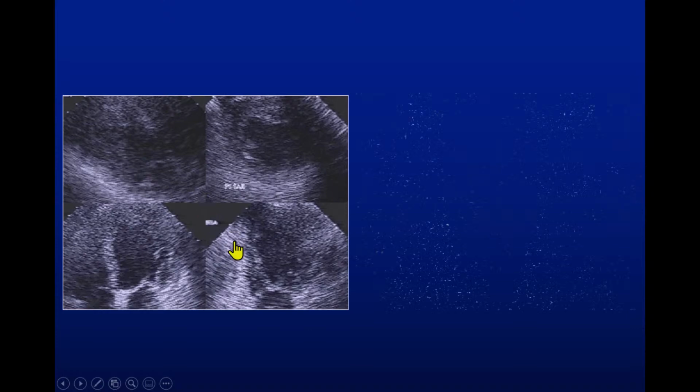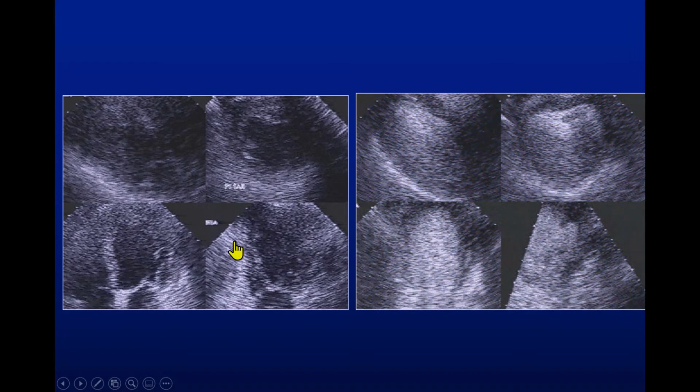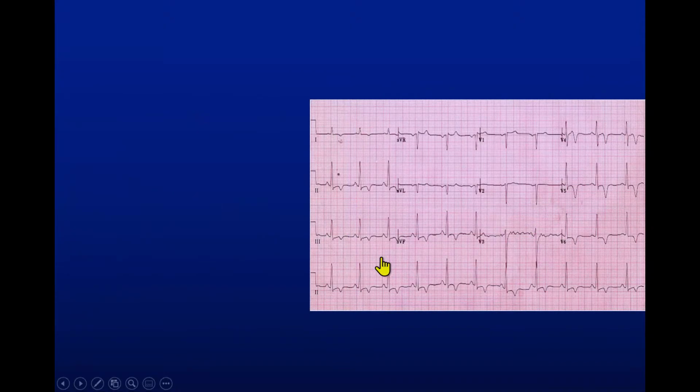Hopefully it works. Maybe it's not working. That's okay. Even on a still frame you could tell. I could not see anything here, but on this still frame you could see an aneurysmal dilatation in a very unusual situation, meaning in the middle of the anterolateral wall. So at times we extrapolate, and I read this patient as normal before because my eye extrapolated this area here to be normal and didn't see much in the anterolateral wall. And got a call from our colleague and said, the EKG is very abnormal. And that was in the early days of contrast and ultrasound enhancing agents.